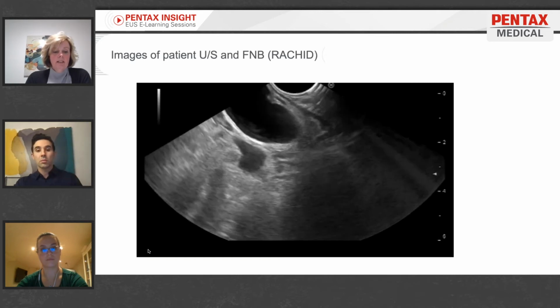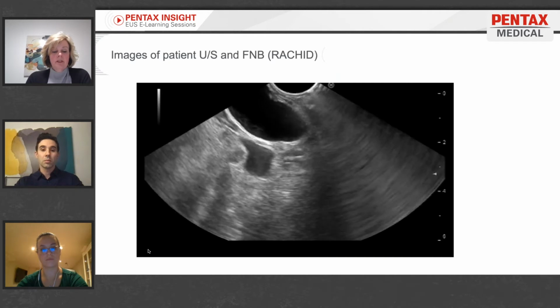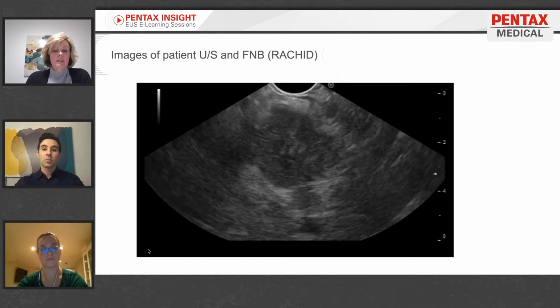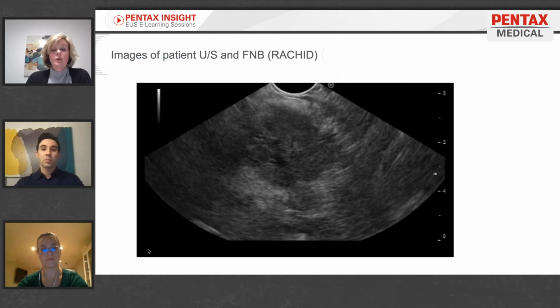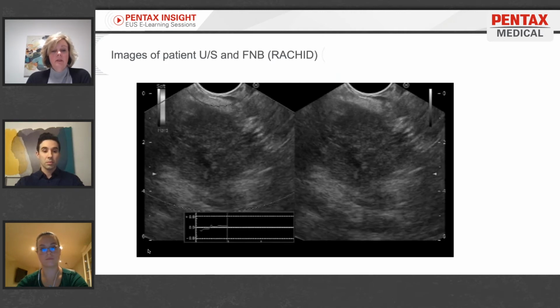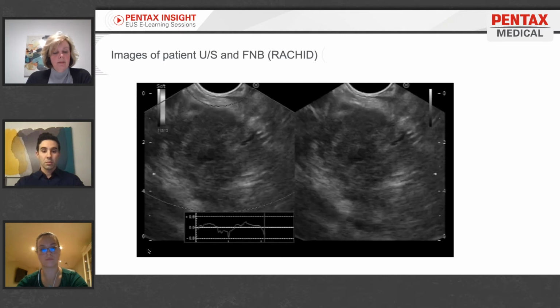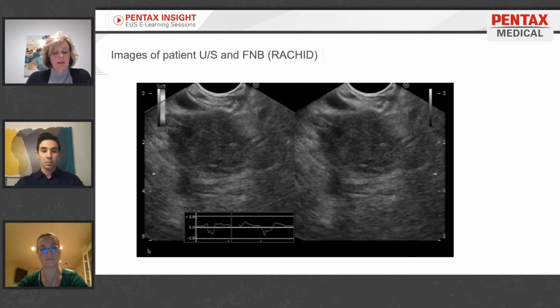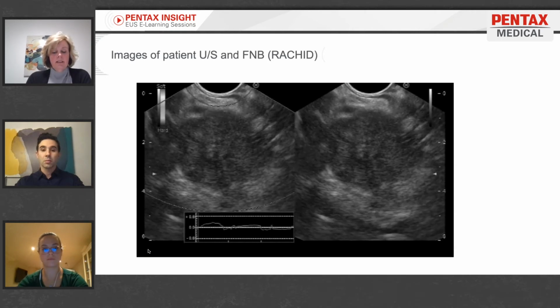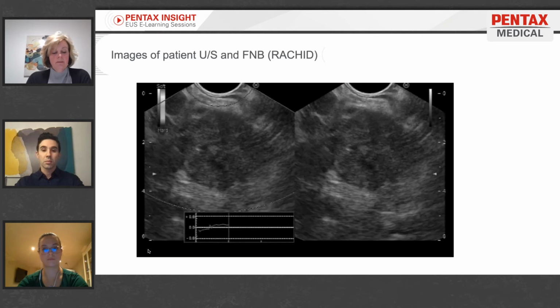During an FNA, cell fragments and blood cells are aspirated and the morphology of the cells is examined for diagnosis. Whereas in an FNB, the goal is to obtain a core tissue sample and the architecture of the tissue is examined for diagnosis. The type of medium that the specimen is placed in will also differ between an FNA and an FNB. For an FNA, usually the medium is Cytolit, because Cytolit lyses the red blood cells and preserves the specimen.